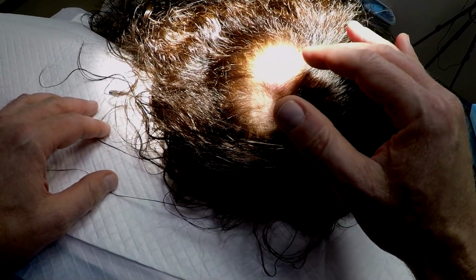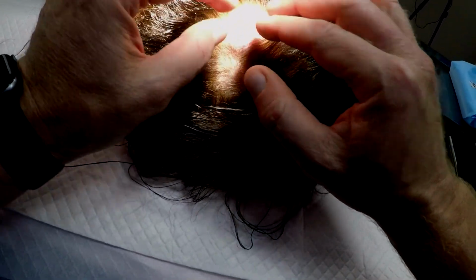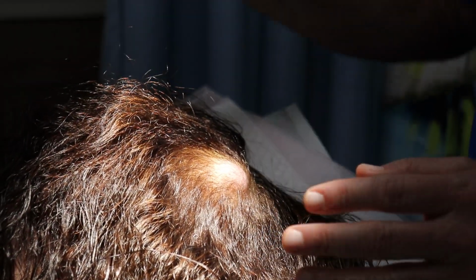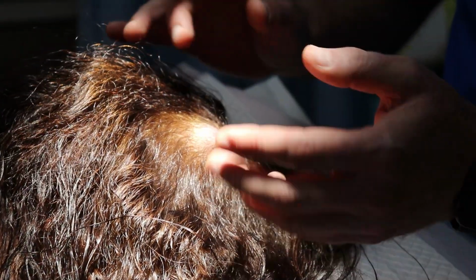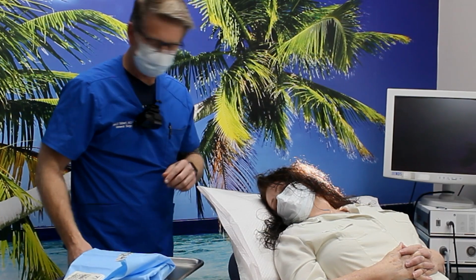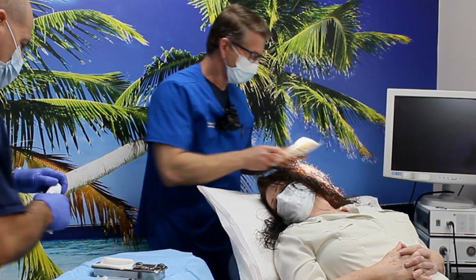The trick here is to not shave the head, because long, beautiful hair doesn't need to be shaved. So what I try to do is we'll use some KY jelly to goo this hair out of the way. And surprisingly, you got some KY? Yeah. Surprisingly, there's very little risk of scalp infection, so the KY jelly doesn't get in the way of that at all. Just squirt some KY there and we'll get you all gooed up.